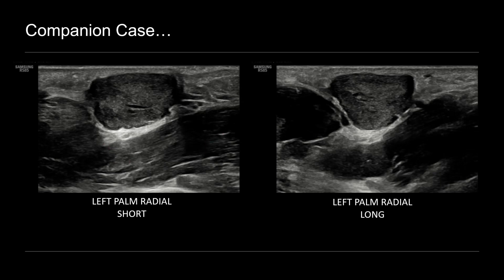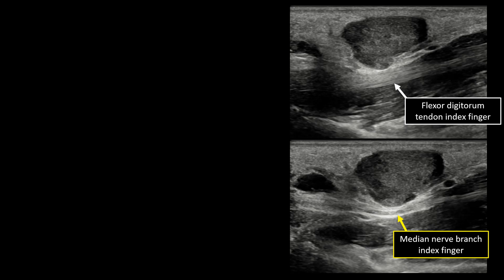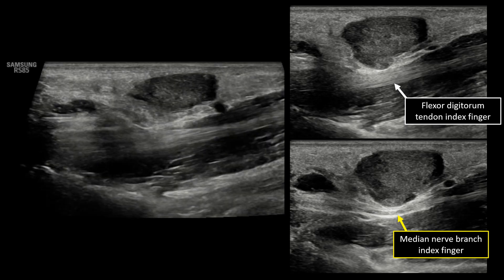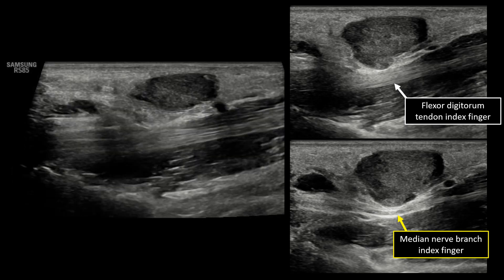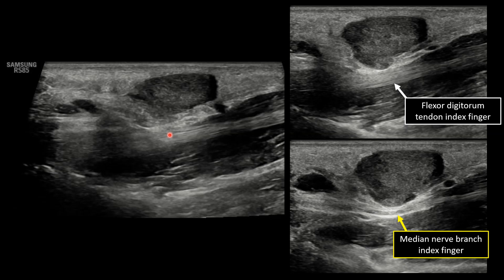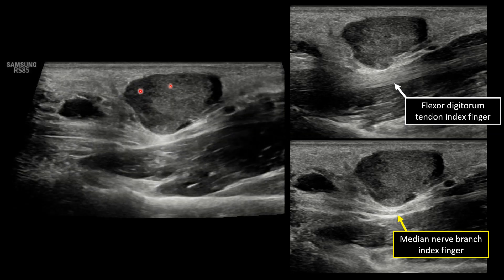When we adjust our transducer, we can see that the posterior aspect of the mass does abut a flexor tendon. This was the flexor digitorum tendon leading out to the index finger. And also in that same plane, when we turn slightly off axis, we can see that it also abuts this thin hypoechoic curvilinear structure, which is a median nerve branch headed out to the index finger. We want to evaluate the relationship with this structure and the underlying tendon and neurovascular structures. When we evaluate this with real-time imaging — here we're having the patient flex their second finger — notice that the mass abuts the flexor tendon but does not significantly move with the tendon.